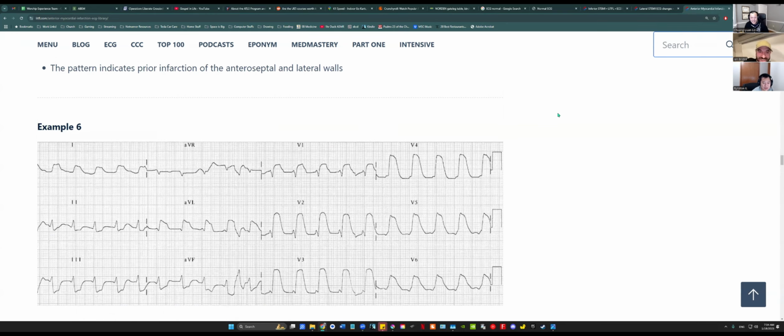No, because they're elevations all of them everywhere, except for the inferior, right? Oh, good. Hey, look, depressions. You guys got this within seconds. That's amazing. That's a dead man. It's an EKG of dead meat.